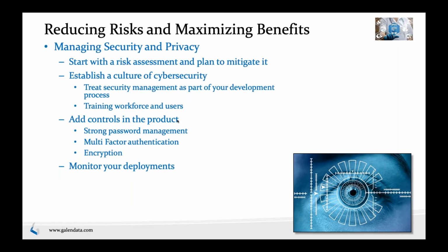And then encrypt, encrypt, encrypt everywhere. Encrypt when you transmit information over the network, even if it's your internal network. Assume that everything is insecure. So you always encrypt in transmission, and you encrypt in storage. If you're storing on your device, encrypt it there. If you're storing it on your cloud, encrypt it there. If you're storing somewhere else, make sure there's encryption. Encryption can again have usability challenges, but that's something we have to deal with.